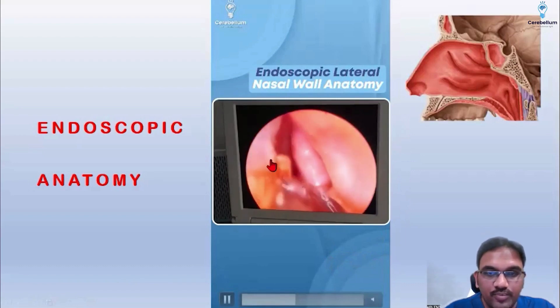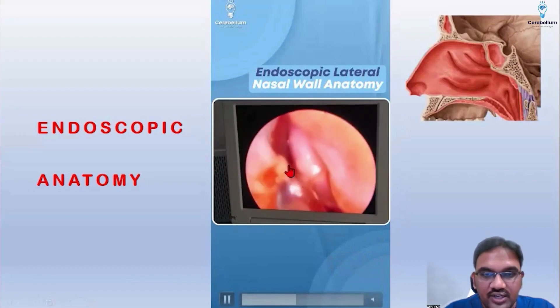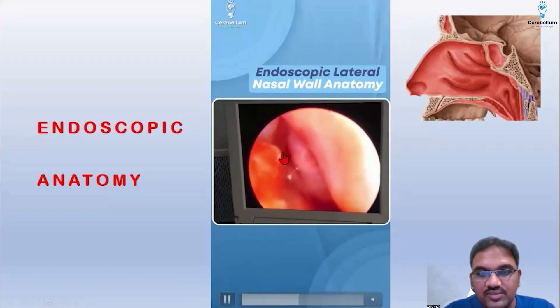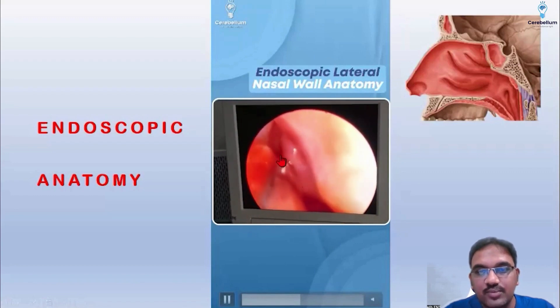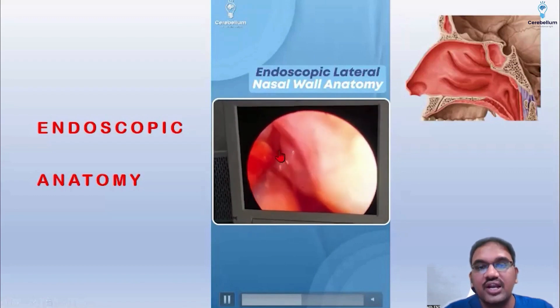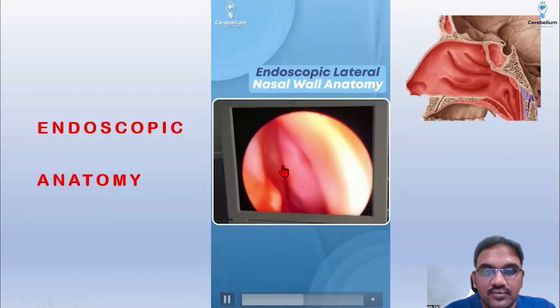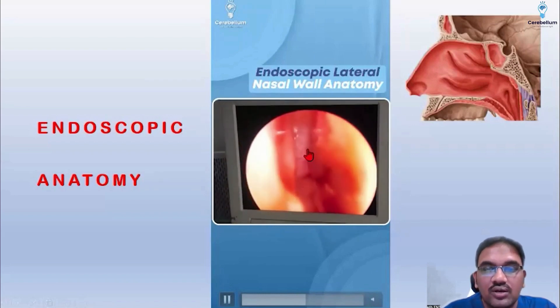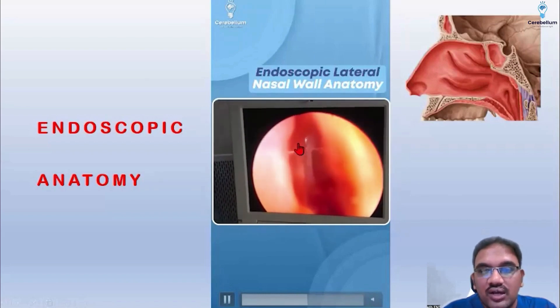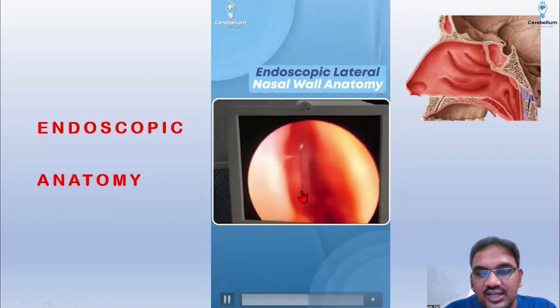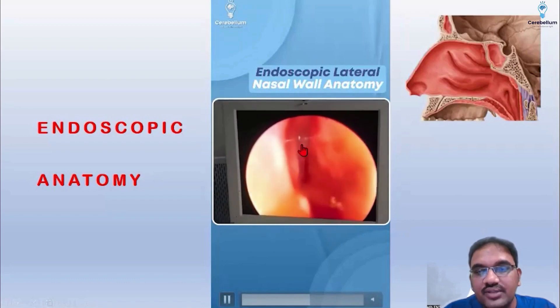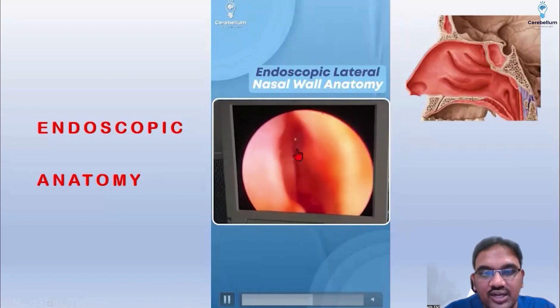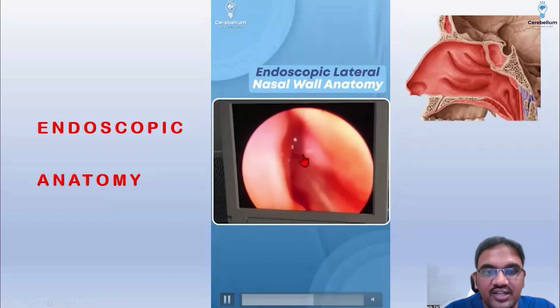You can see here — this moving bone is the uncinate process. The thin bone that is moving easily is the uncinate process; you can identify the uncinate like that. This is the ethmoidal bulla, and this is the uncinate process. In between them there is a space called the hiatus semilunaris — my elevator is going into that hiatus.